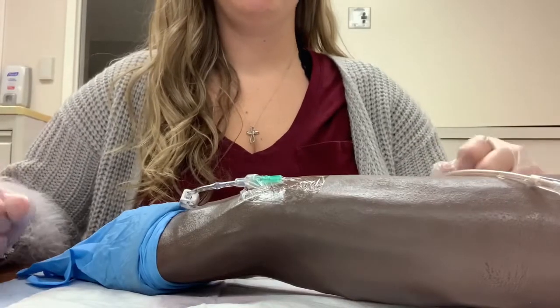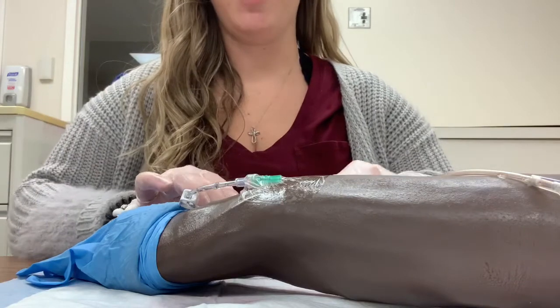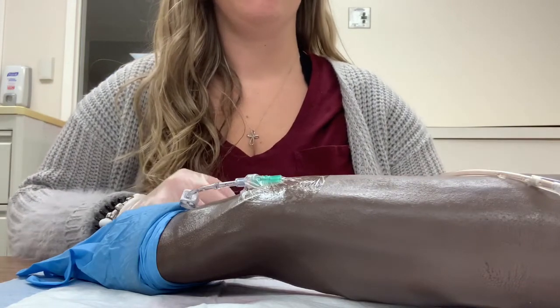Hi, my name is Erica and I will be your student nurse today. Today I will be administering ceftriaxone through an existing IV line.